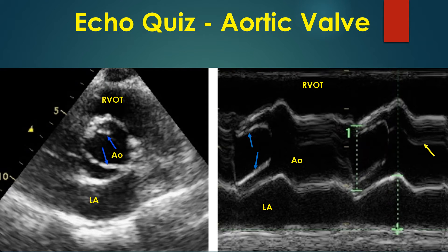Two-dimensional parasternal short axis image shows the aortic valve in cross section, with right ventricular outflow tract anteriorly and left atrium posteriorly. The aortic valve is in open position and two leaflets have been marked by blue arrows.